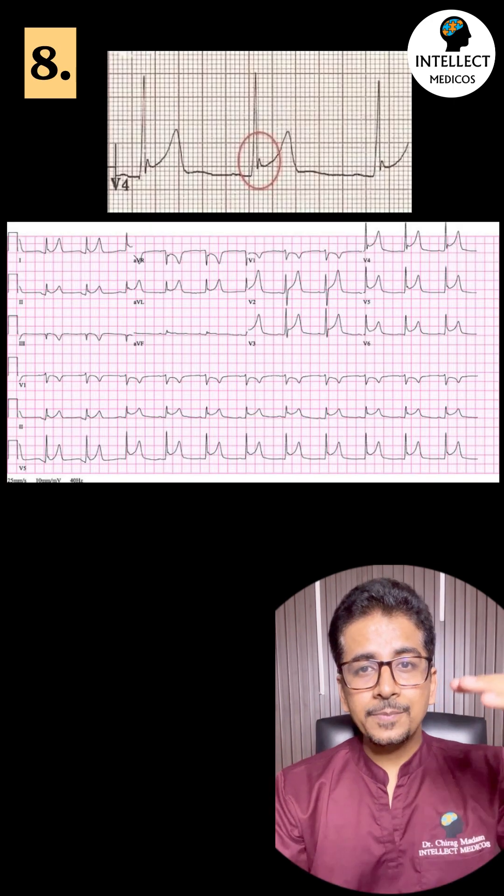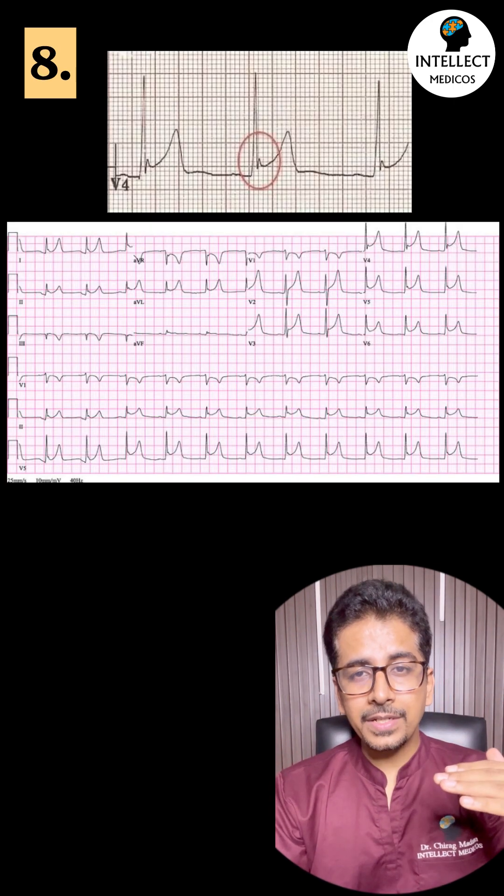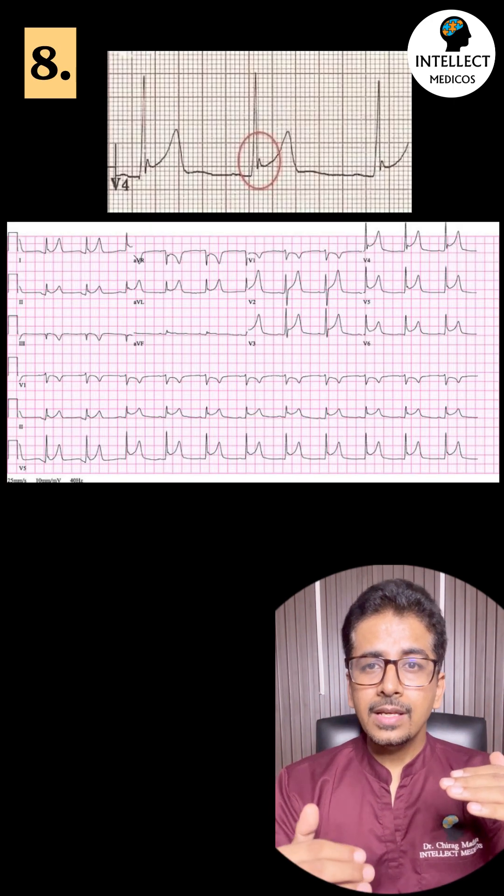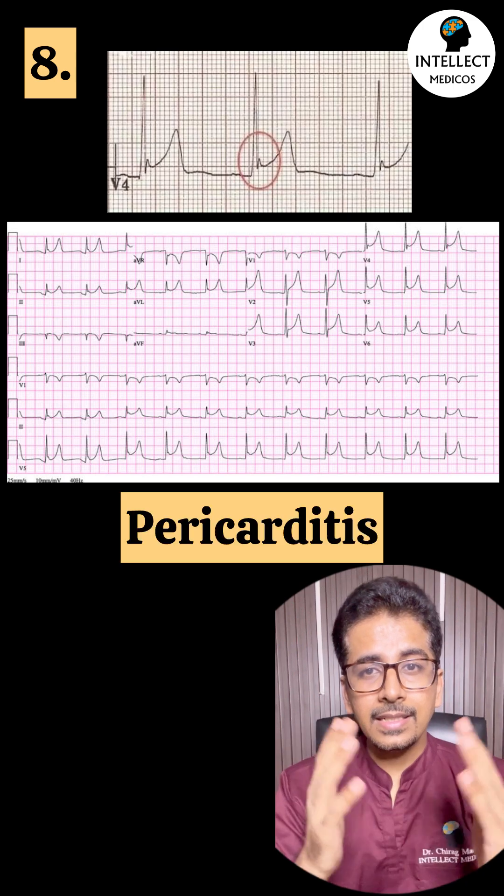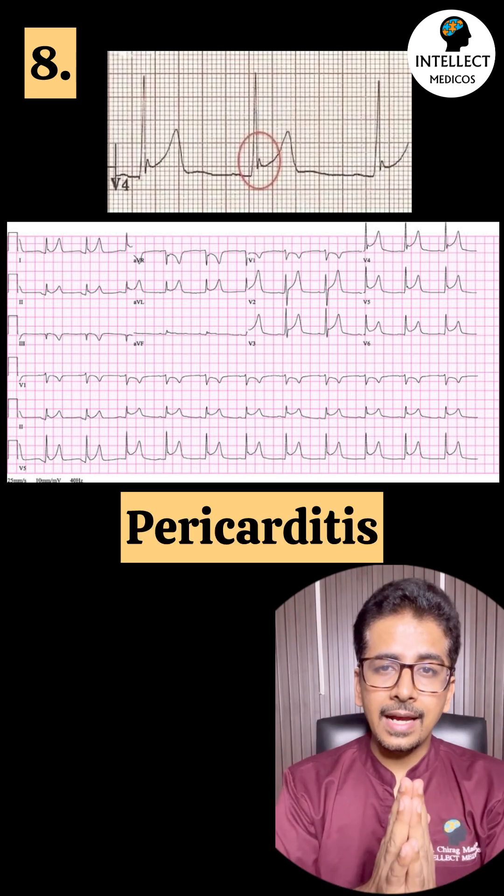Eighth: there is PR segment depression with ST elevation in all the leads. This is pericarditis.